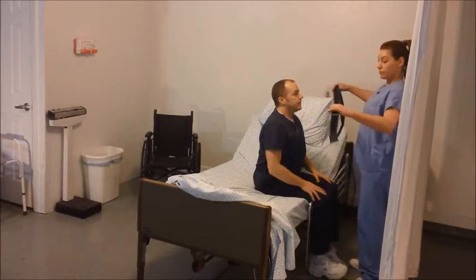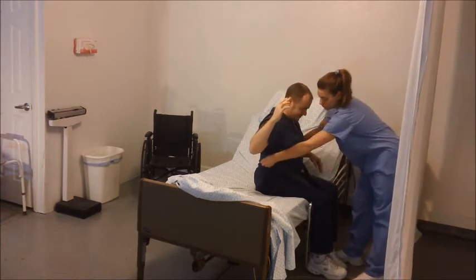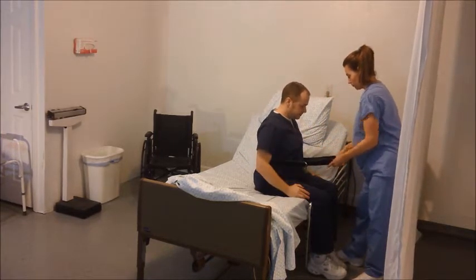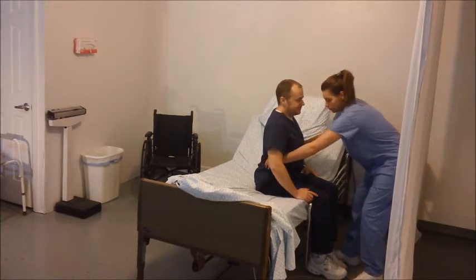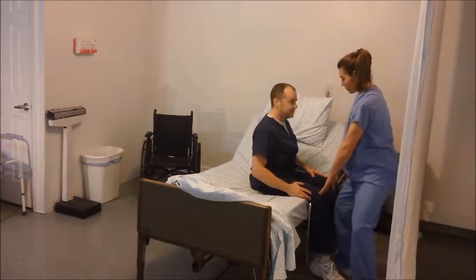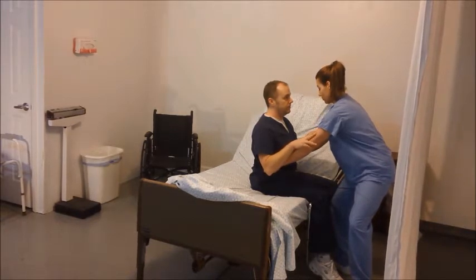Apply a transfer belt securely at the client's waist over clothing or gown. Stand facing client, positioning self to ensure safety of candidate and client during transfer. Provide instructions to enable client to assist in standing, including pre-arranged signal to alert client to begin standing. Count to 3 or say other pre-arranged signal to alert client to begin standing.